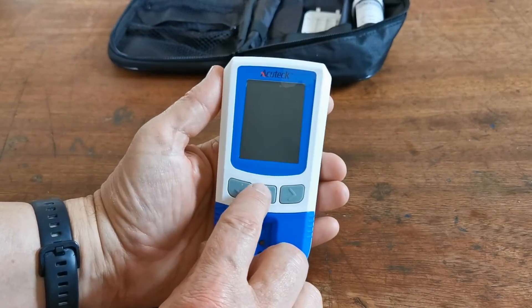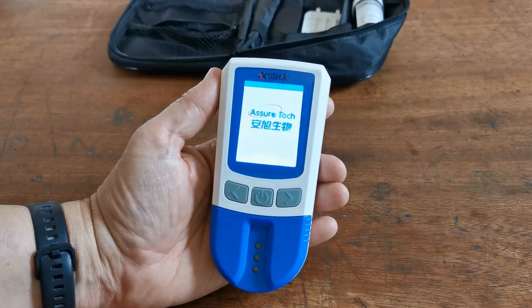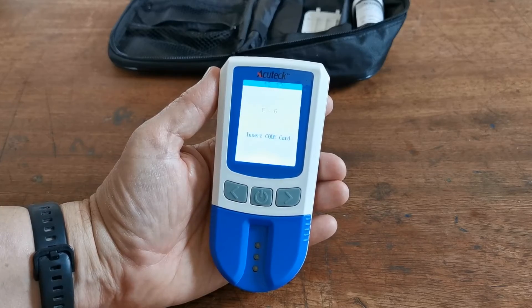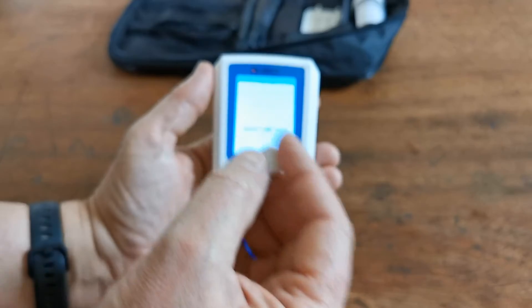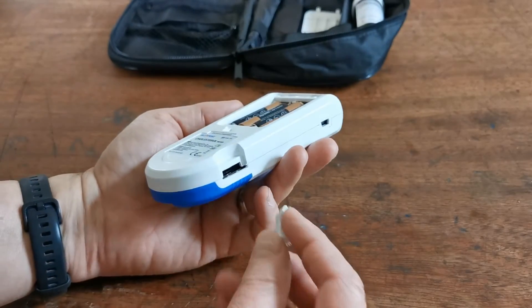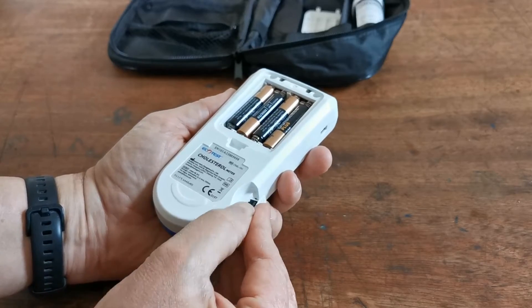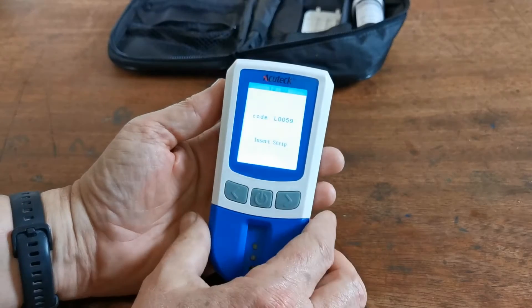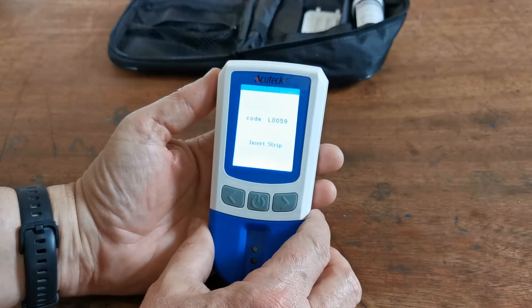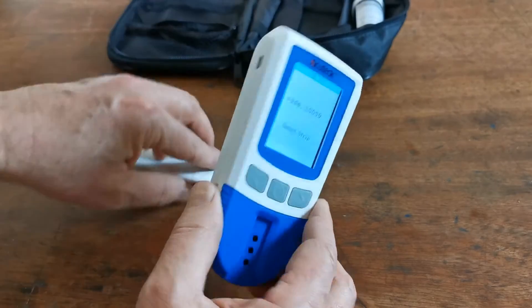Turn it over and depress the power button. The first thing it's going to ask you to do is insert the code chip. This is one of the code chip devices supplied with the test strips. The port for this is on the side of the meter and it is simply pushed into the body of the meter. It should then recognize the test code chip — L0059 in this instance, though yours may be different.